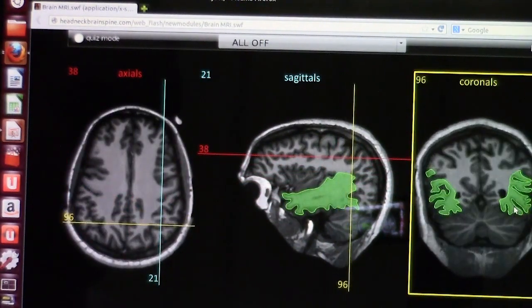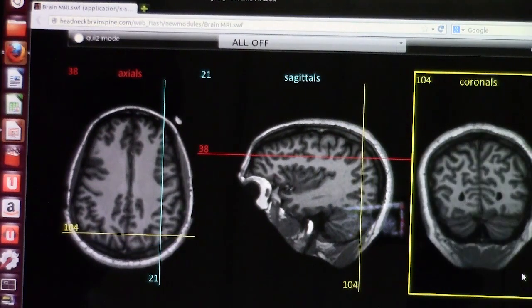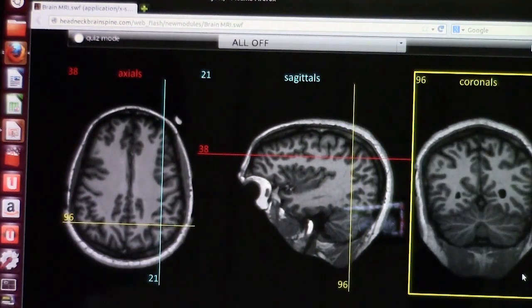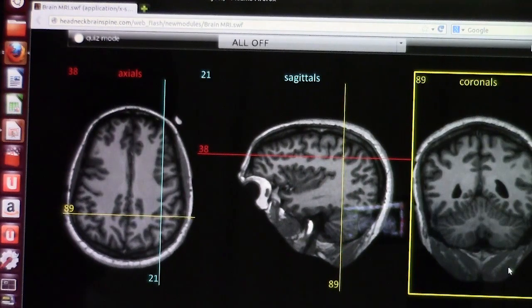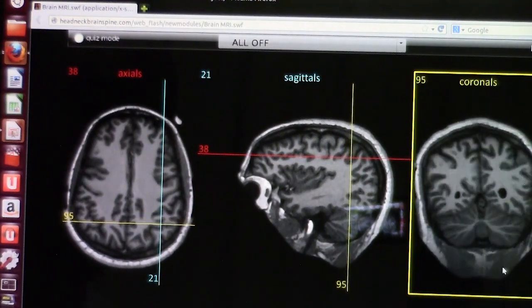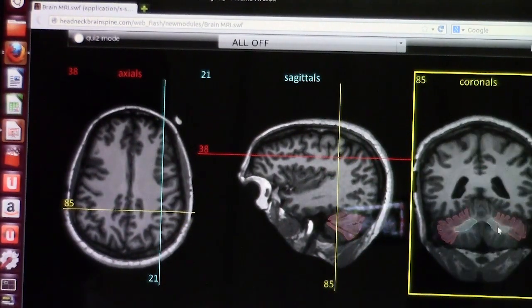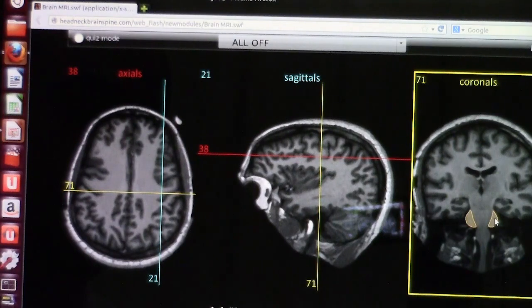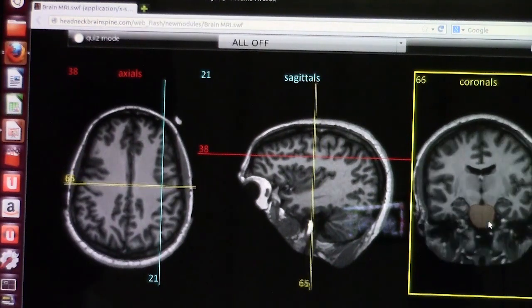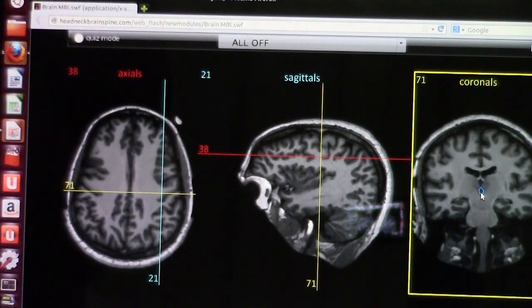The coronal section is very helpful for reading brain MRI. If there is any atrophy, it would be very obvious here. You can look at the cerebellum to see if the two lobes are separate or fused together, as in rhombencephalosynapsis. You can also appreciate ventricular dilatation. Here you can see the middle cerebellar peduncle, the lateral ventricles, and the third ventricle.